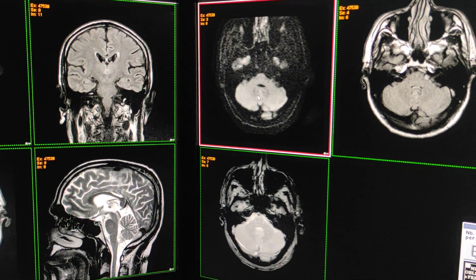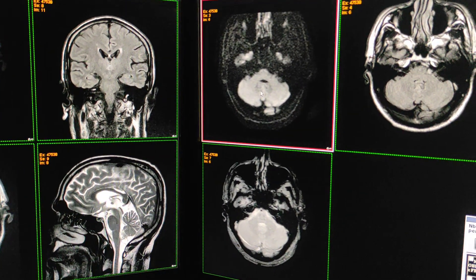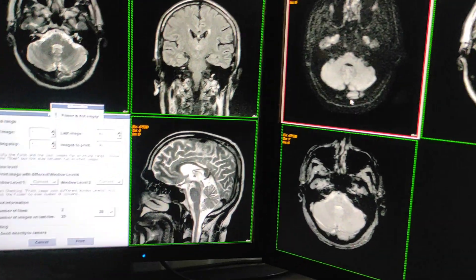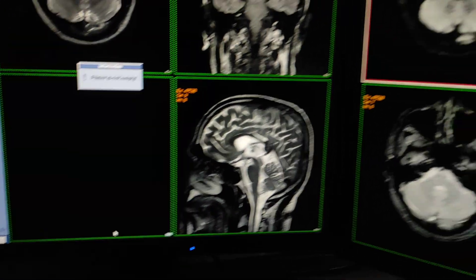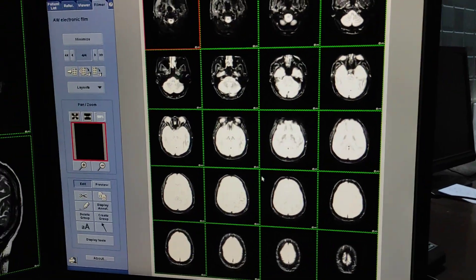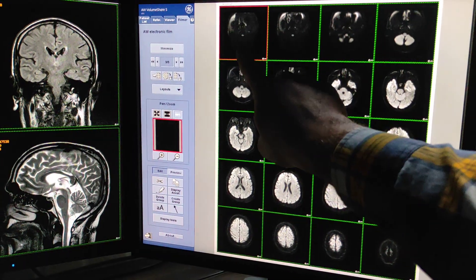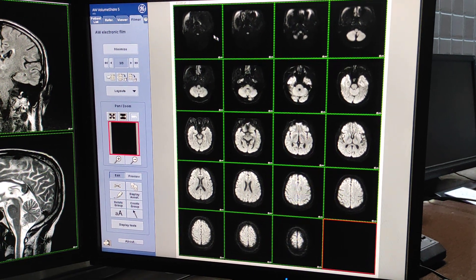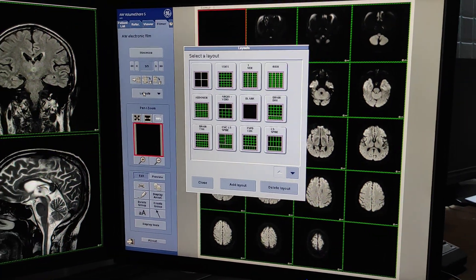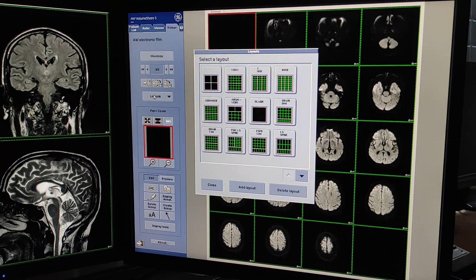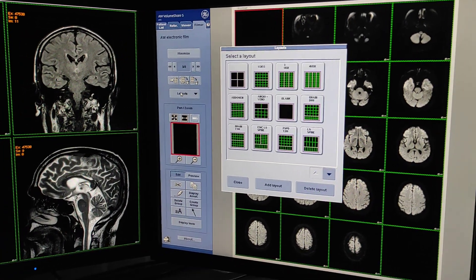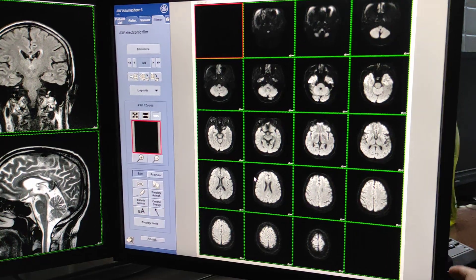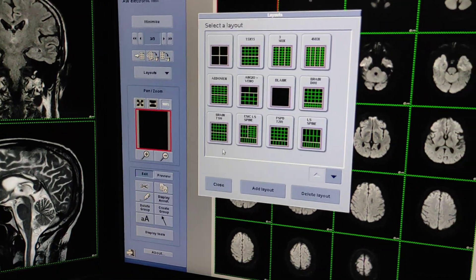For the second film, click on diffusion. I have taken 20 images for diffusion also. Click on the box, then click F4 — the interface will open. Click print. Now cut the first image and the second image. I am giving one T2 big film, one coronal big film, diffusion with gradient in multi-layout format, and T1 with sagittal T2 in multi-layer format.